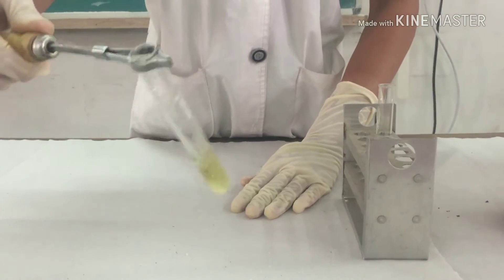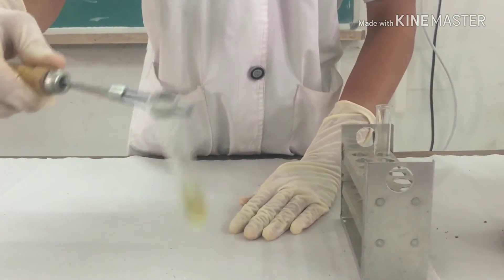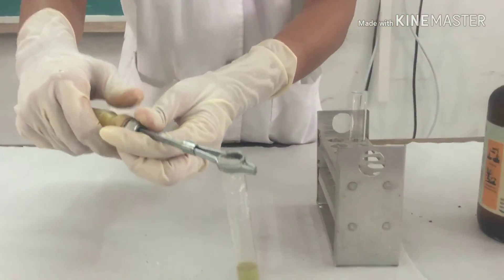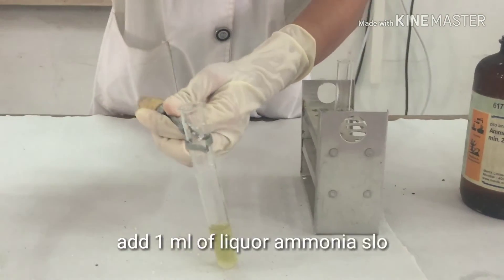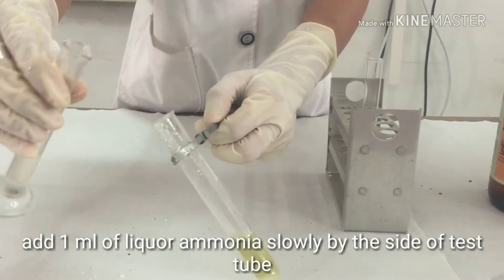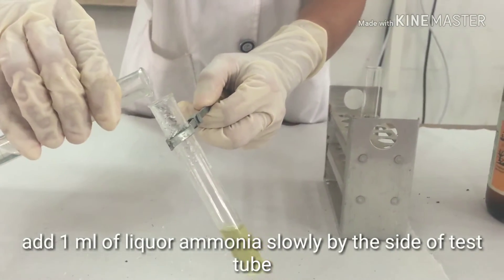Shake the contents well and slowly add ammonia solution drop wise to the side of the test tube.